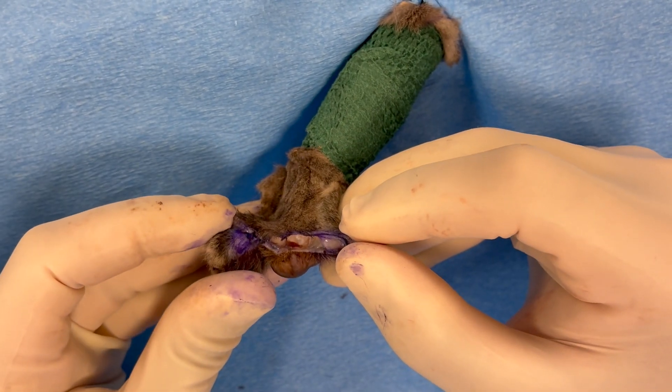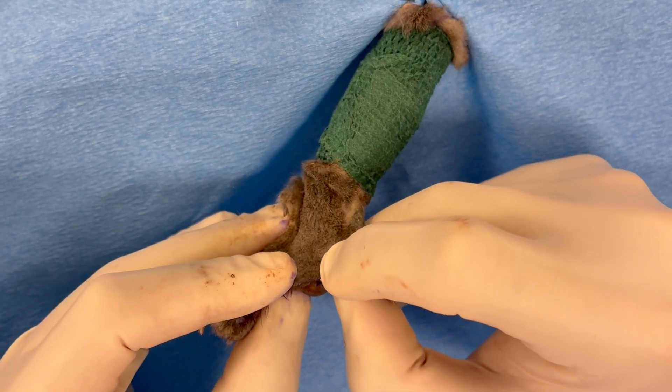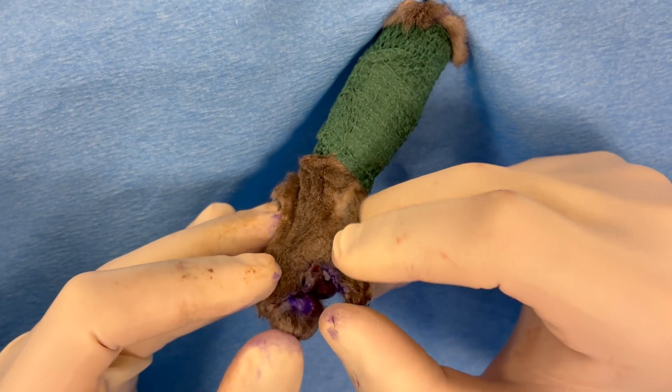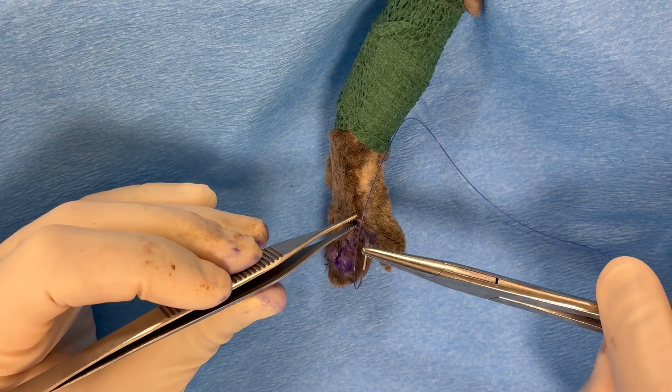You can close the skin of each digit separately, or suture the dorsal skin to each other and suture the palmar skin to each other. There are pros and cons to each approach.